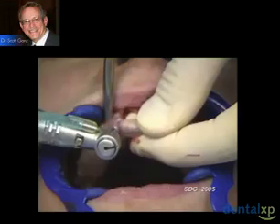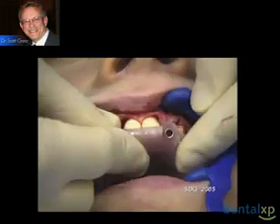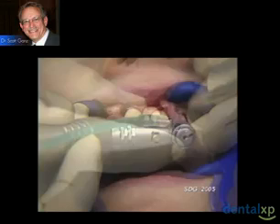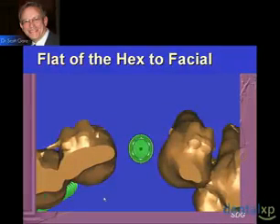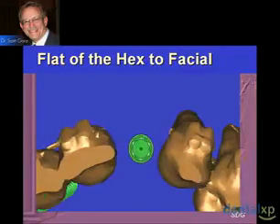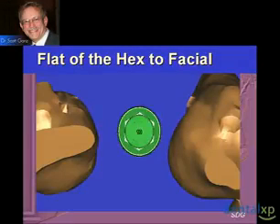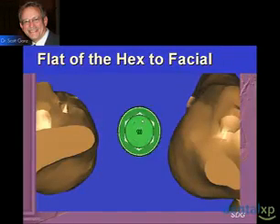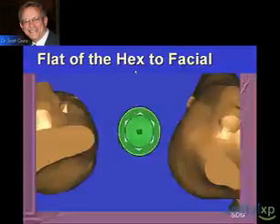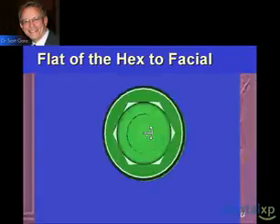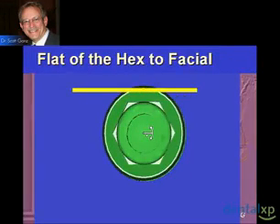Here you see that the apex of the hex is pointed towards the facial — but we want the flat of the hex towards the facial. We can utilize the virtual tools in the interactive software application, such as Simplant, to point the flat of the hex towards the facial. Once we do that, it opens up another whole world of being able to connect to the restorative component — here we see where the dot on the prefabricated abutment correlates to the flat of the hex on the facial, and we already have a predefined margin in this area.